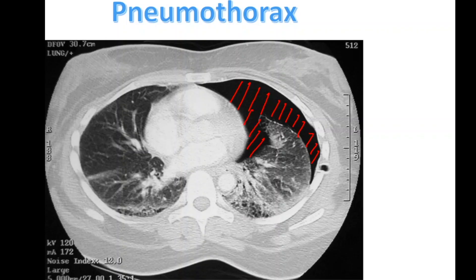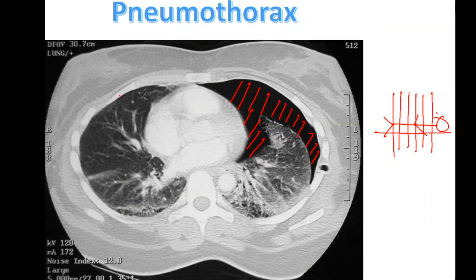Here we can see a patient who is laying on a gurney, and we're taking slices through their thorax. This is the anterior portion, this is their back down here, this is the left side, this is the right side of their body, and their feet are coming out at us. This is the left lung right here. As you can see, it is not fully inflated — it is deflated. It should be touching the edge of the inside of the thoracic cage all the way around, just like the right one is on this side.